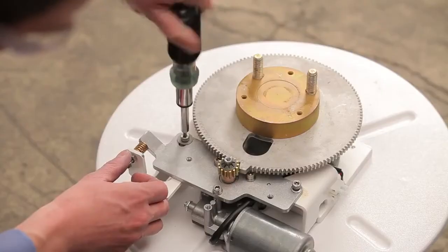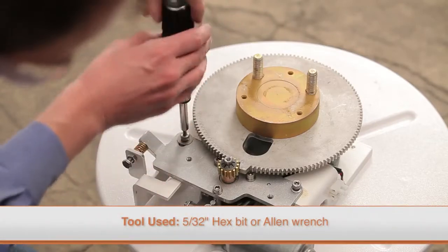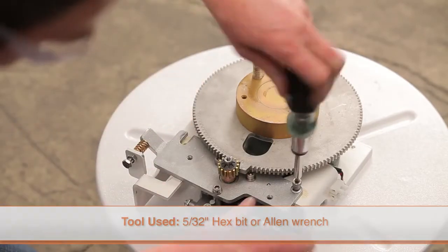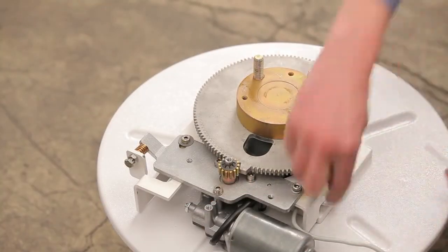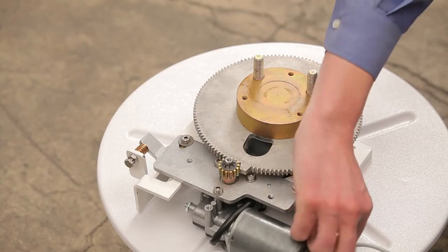To replace the motor assembly, remove the two mounting screws using a hex bit driver or Allen wrench. Make sure to loosen the screws on the terminal block that secure the motor cord and remove the cord from the block before removing the motor assembly.